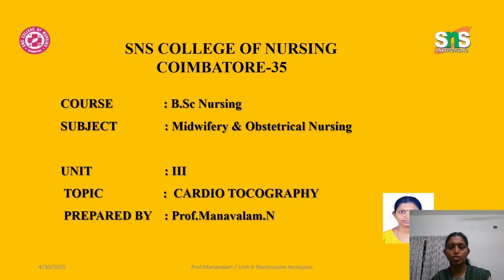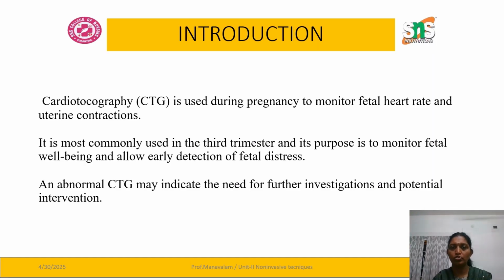In the first part of this video, we are going to discuss an overview of the cardiotocography, how this cardiotocography machine works, and the parameters measured by using this machine. At the same time, the major parameter, that is uterine contraction, and how it is measured by using the cardiotocography, in detail. Let us move on to the topic.